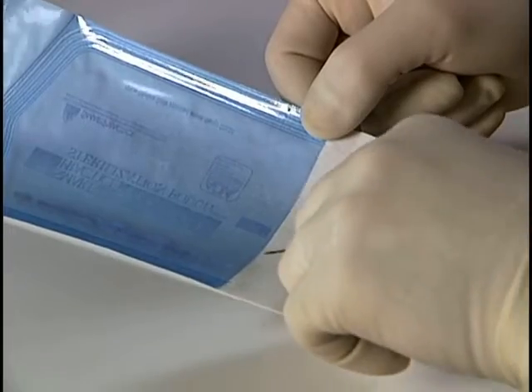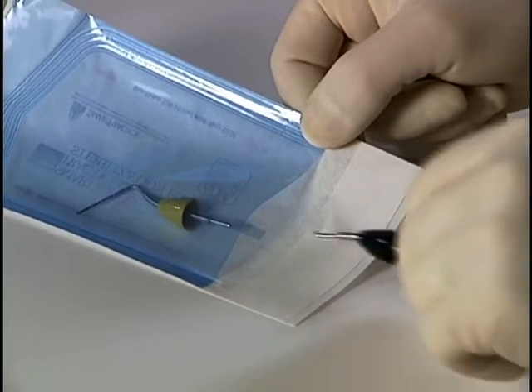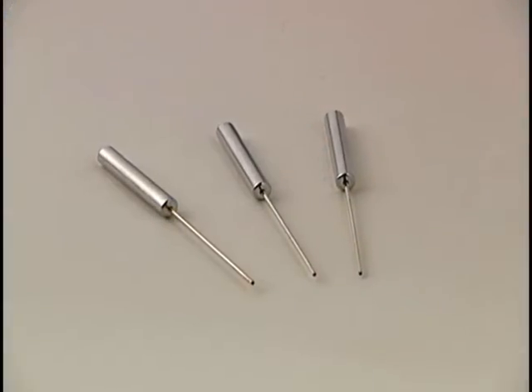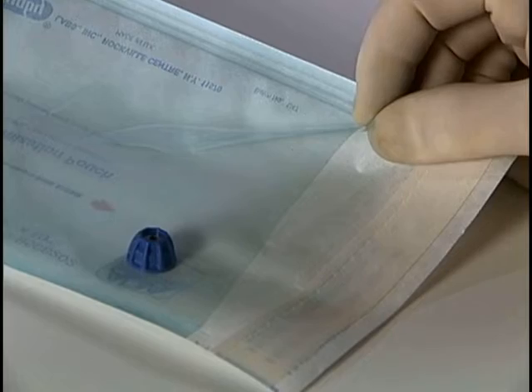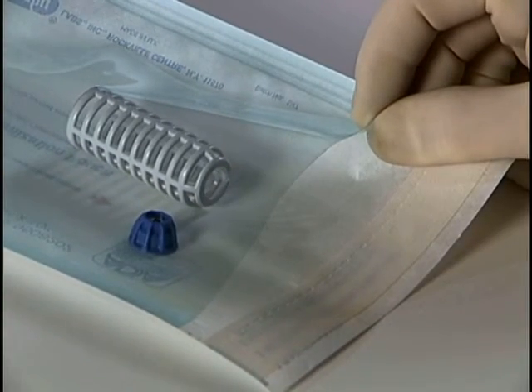The tips for the Calamus pack handpiece should be autoclaved for 15 minutes at 132 degrees C. Calamus cartridges should never be autoclaved. The flow heat shield and the cartridge nut can both be autoclaved at 132 degrees C for 15 minutes.